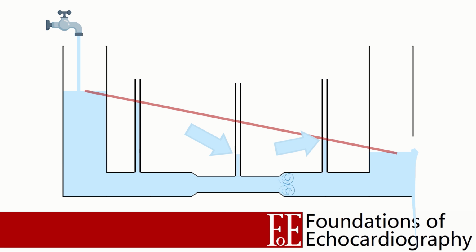The reality, however, is that the sudden transition from a narrow pipe to a wider pipe will lead to some turbulence, which will result in some energy being lost as heat. The greater the turbulence, the more energy is lost, and the less pressure is recovered.